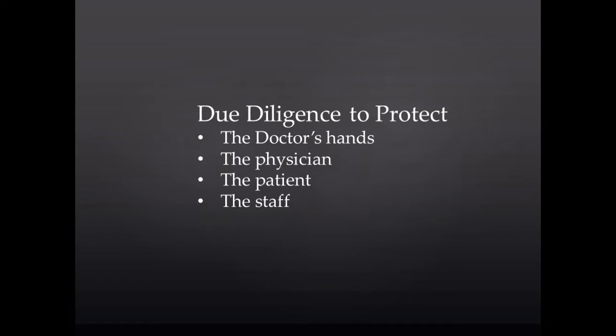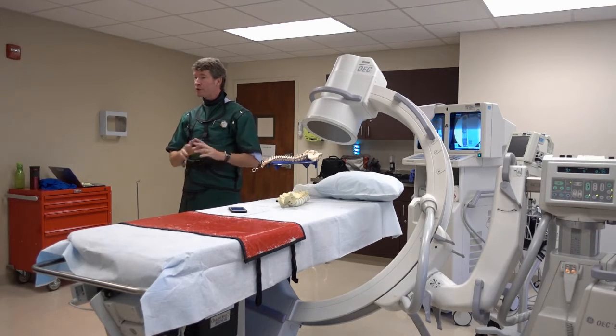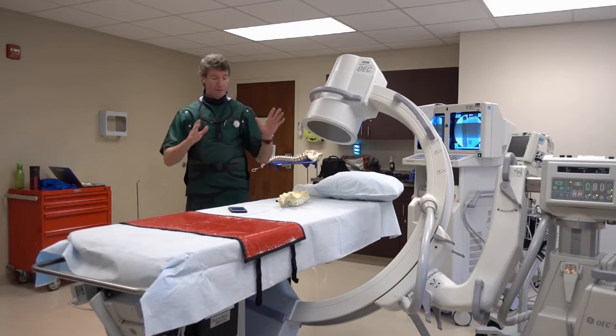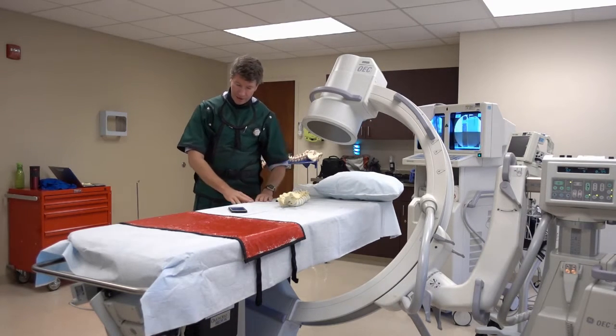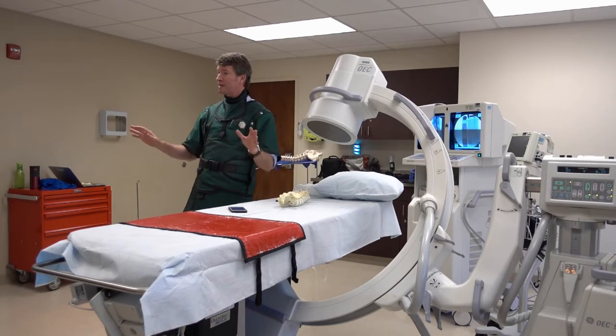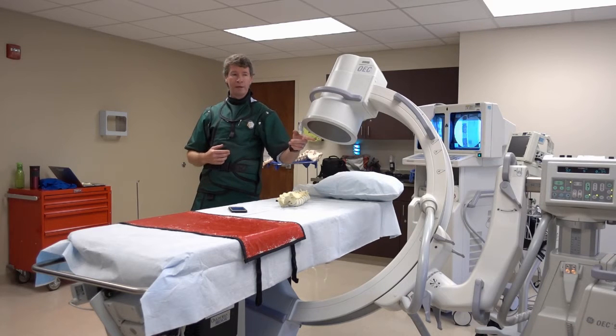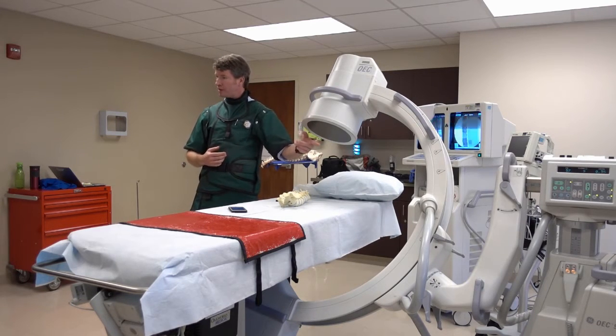Let's see here. All right. Generally, the concepts in terms of safety are, first, and I do it in this way because it's important, first protect the doctor's hands. Why? Because that is the thing that over time will get the most radiation. So number 1, focus on protecting the doctor's hands. Number 2, protect the doctor. And I say that not because I don't care about the staff, I love the staff, but Michelle, you can see, is far away. She's getting 1,000th of the dose that I am.